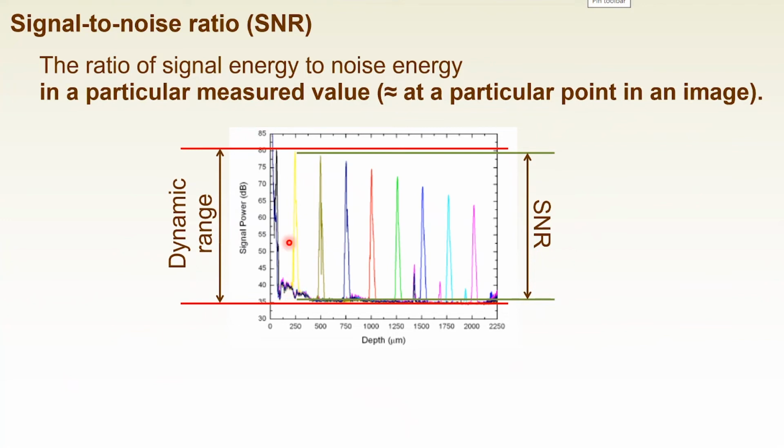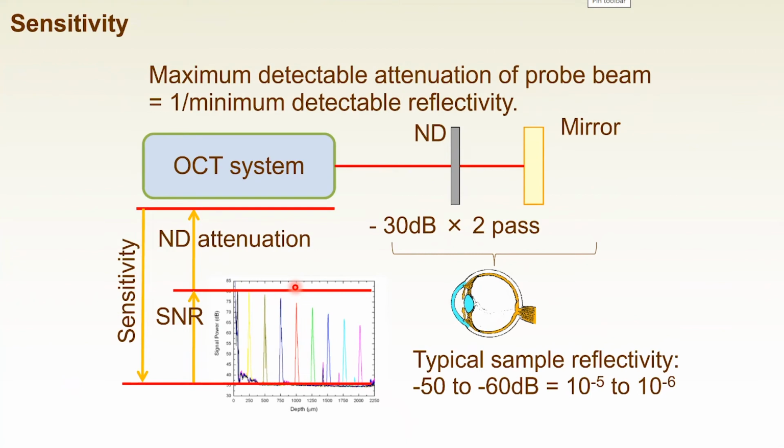Okay, so this means the ratio of the signal at 100% reflectivity to the noise level is the definition of the sensitivity. It's quite similar to the signal to noise ratio. But here we assume 100% reflectivity of the sample at first, and this is not plausible. In reality, it is not realistic to have 100% reflectivity of the sample.